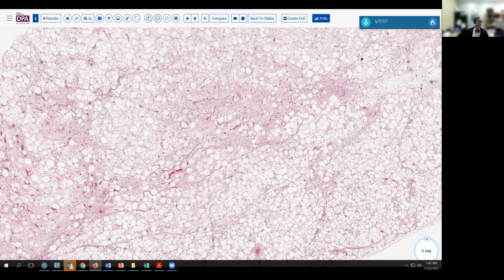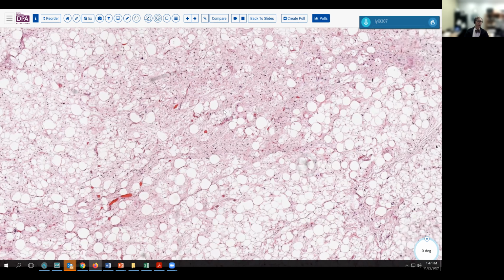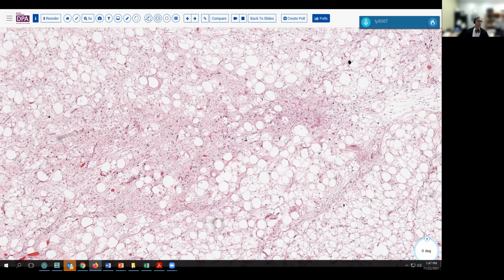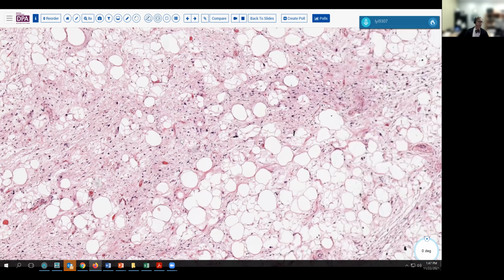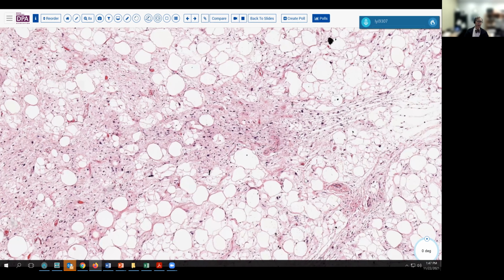So the diagnosis of well-differentiated liposarcoma / atypical lipomatous tumor does not depend upon demonstrating lipoblasts, but is quite easily based on the finding of scattered atypical stromal cells within the fibrous matrix, within the fibrous bands between lobulated fatty tissue and sometimes out in the fat.